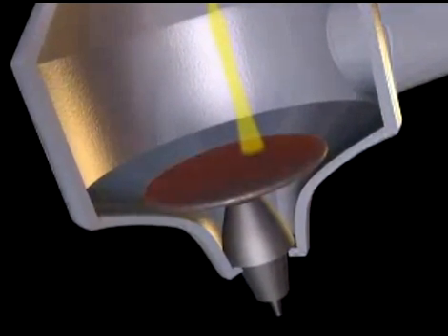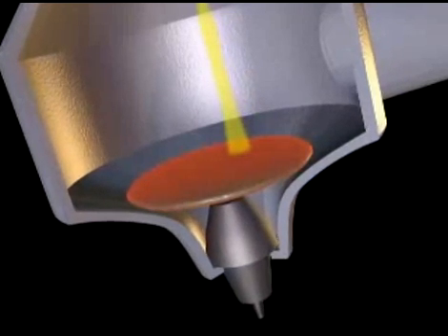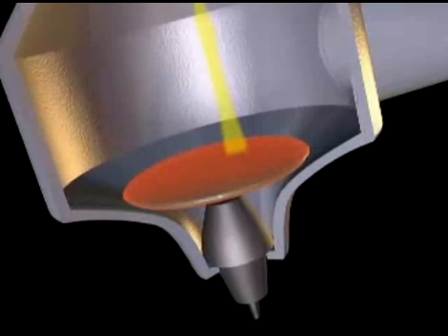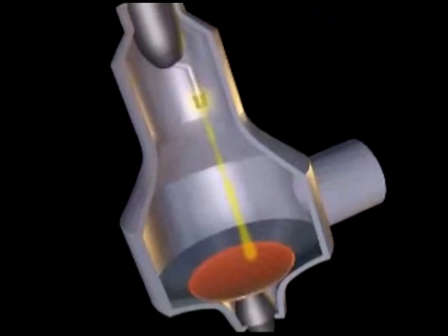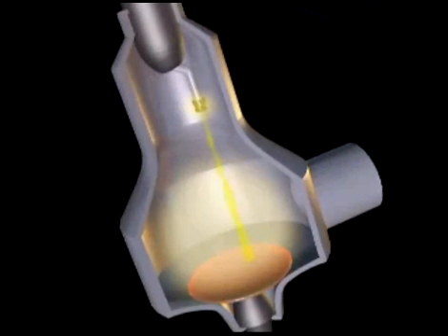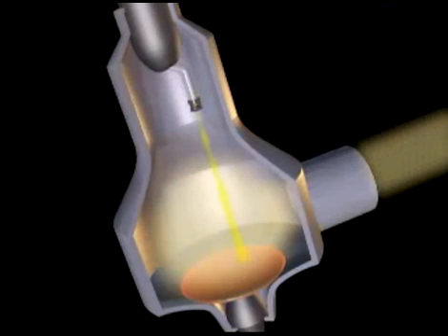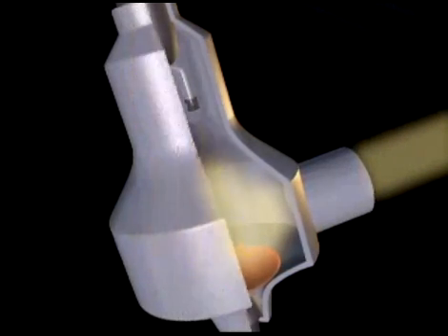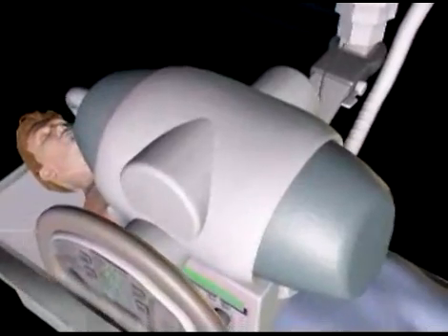The anode, located on the opposite end of the X-ray tube, is a disk made of tungsten, a material that attracts the electrons. When the electrons released from the cathode come in contact with the tungsten, they release energy in the form of photons. These highly energized photons are channeled through a lead cylinder and a series of filters, creating an X-ray beam.